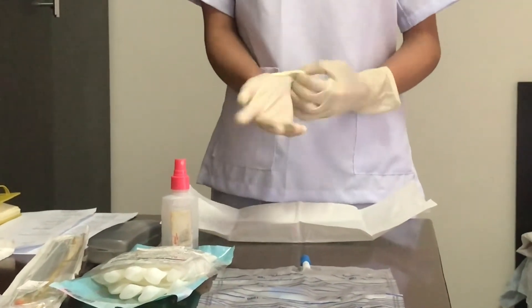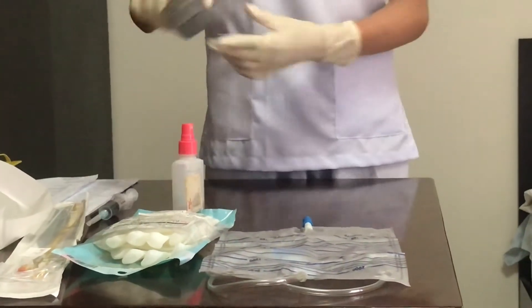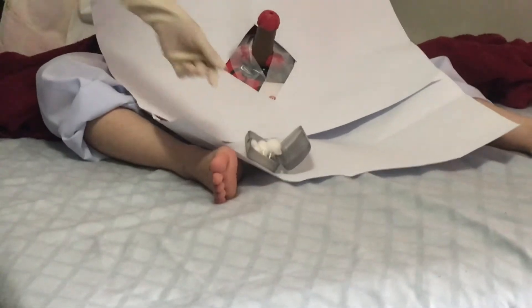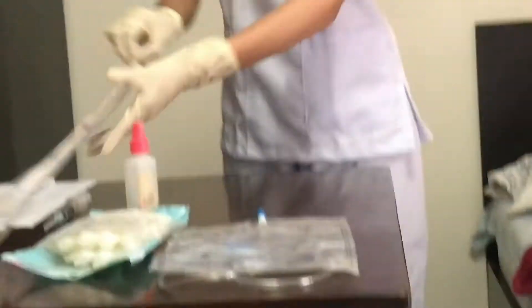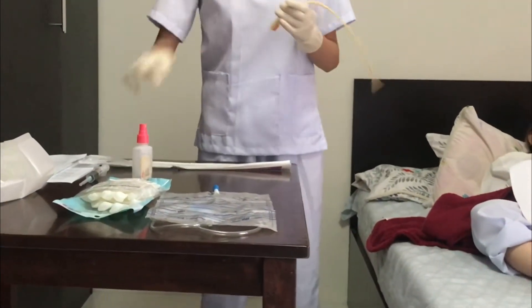Prepare the antiseptic solution using iodine swab or cotton balls with betadine using forceps. Attach the saline-filled syringe to the side port of the catheter, inflate the balloon, and leave the syringe connected to the port.